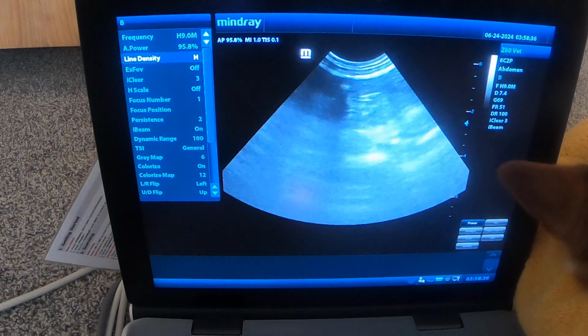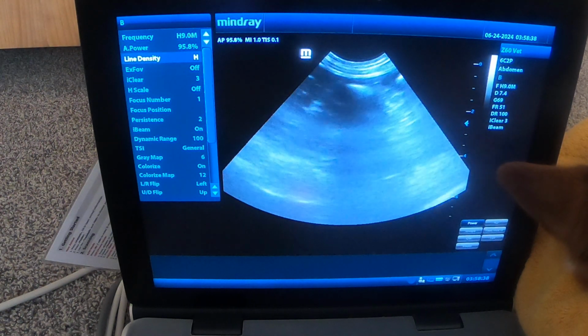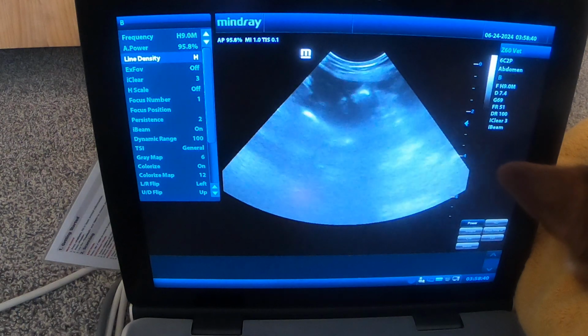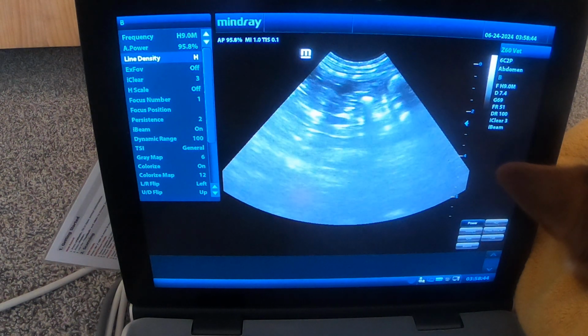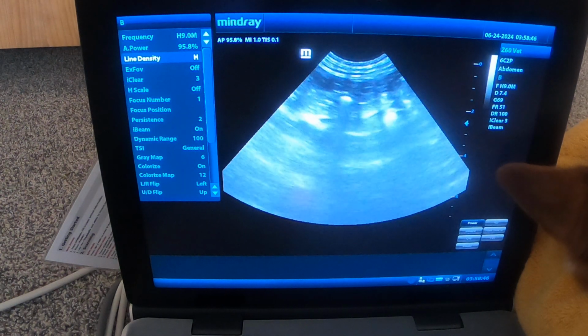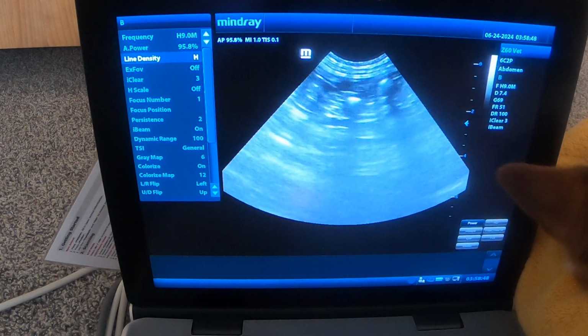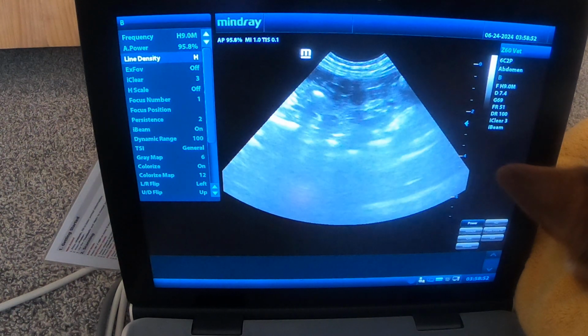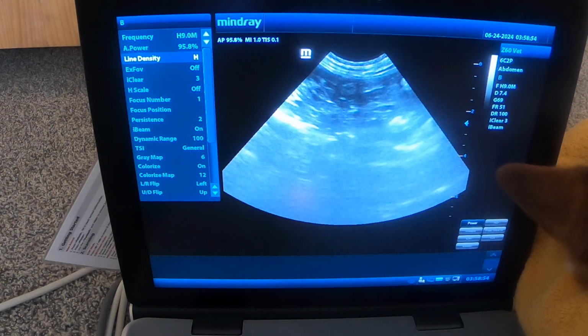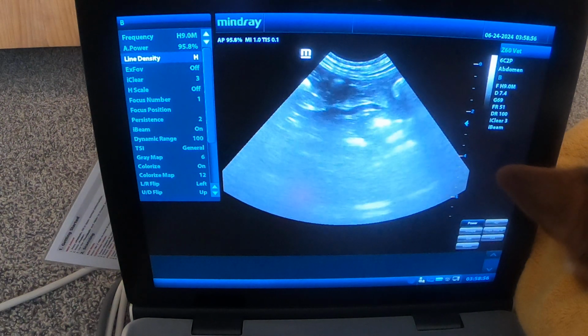Again, it's not just because we're doing it fast. It's actually a focused assessment looking for this fluid scoring system. We can talk about it a little bit more in detail. People are kind of moving away from just doing a FAST scan. They're doing more of this whole global view, incorporating our FAST scan with our TFAST, and also incorporating Vet BLUE too.